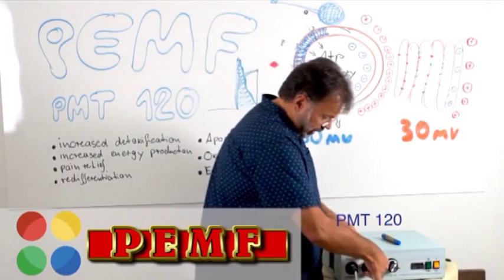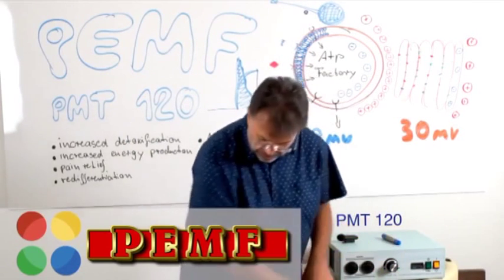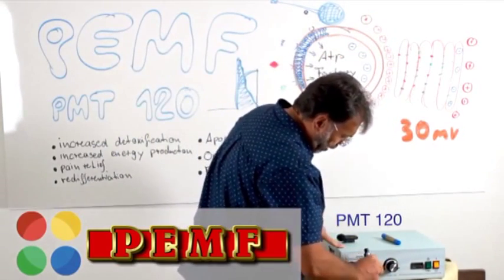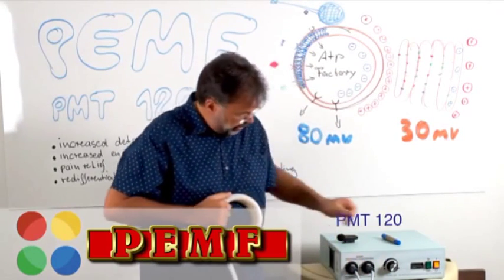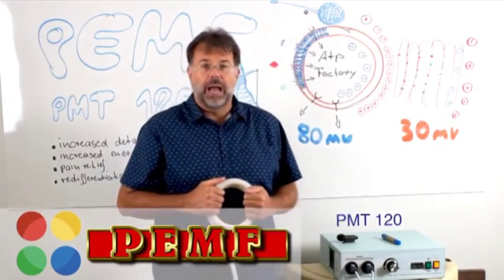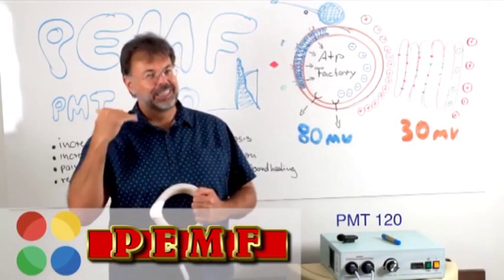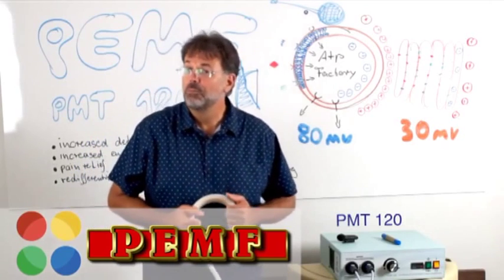There's only one risk that can go wrong. One risk. And that means you plug it in, and the person before you, or you yourself, haven't turned it down. And let's just say you hold this device here and it's all the way up, and you turn it on and bang, you get a real smack. That's all that can happen. So don't start with your brain. Really start always at a body part which doesn't hurt that much, and then move around.